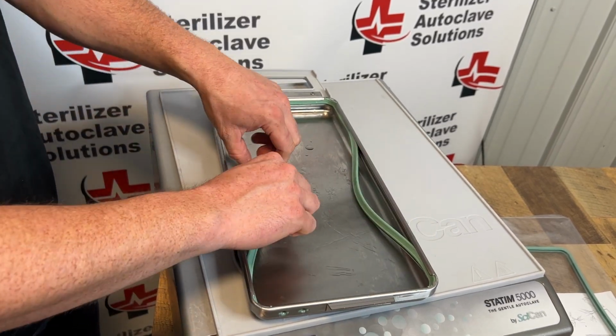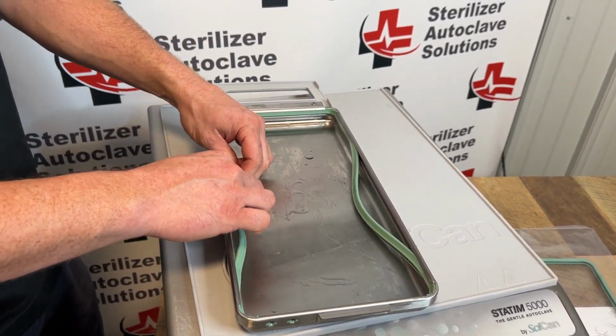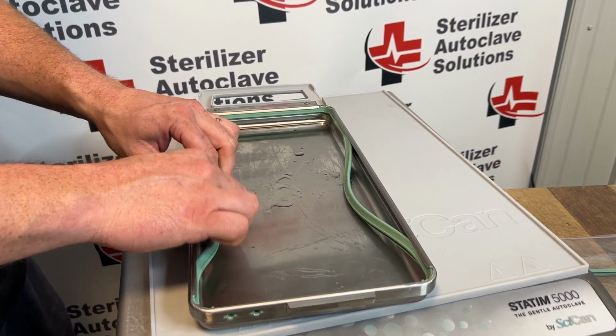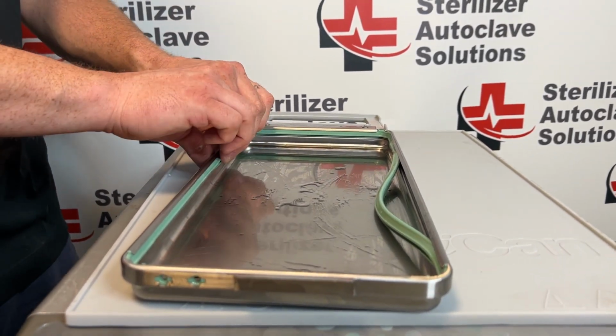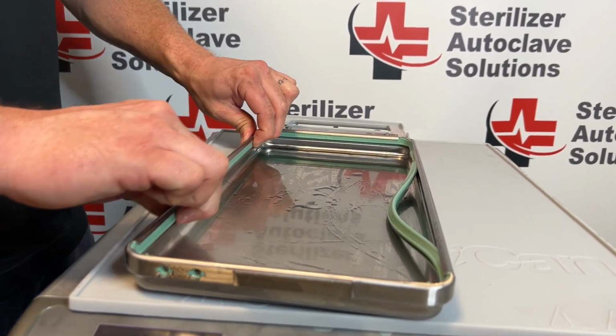On your long sides, we're going to split the difference, go right in the middle, kind of press in right there in the middle, and then work your way. You will get bubbles. That is okay. The seal will slide into place.